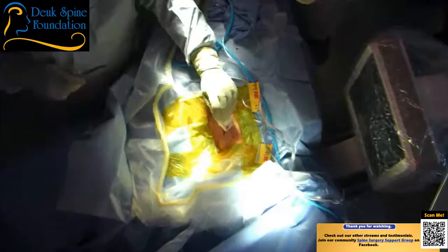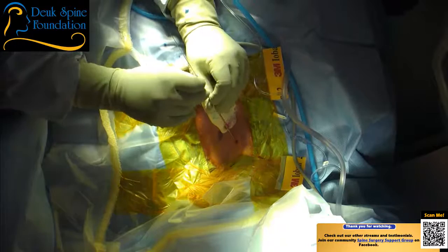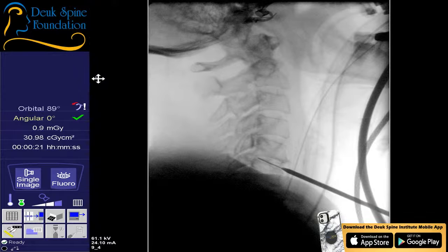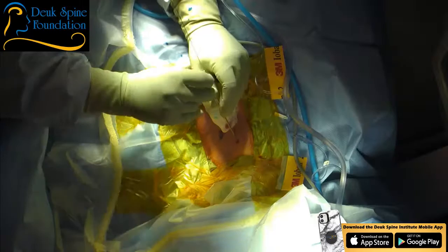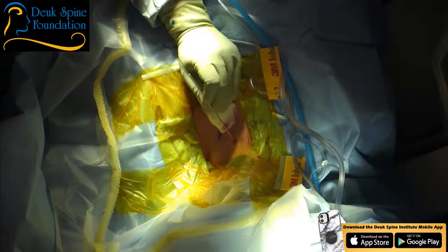We're going to move across the disc to the opposite side — her right side — to get that giant herniation out. You can see the endotracheal tube is deviated right where I'm at because I'm pushing it over with this three-and-a-half millimeter tube. I'm going to advance my dilator into the disc space through the anterior ligament into the disc, and I'm going to move it to the back of the disc. I'm going to try to do that manually.